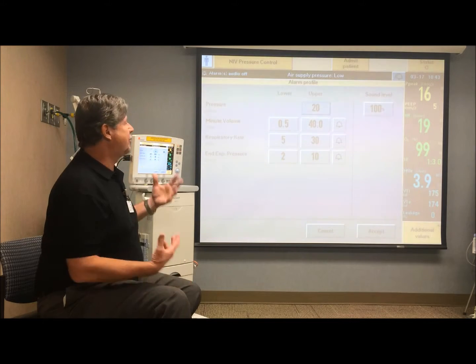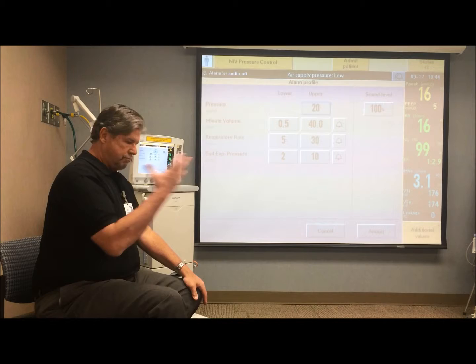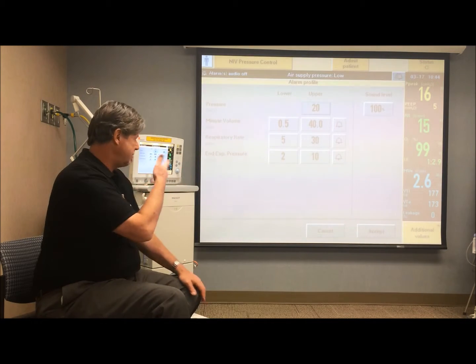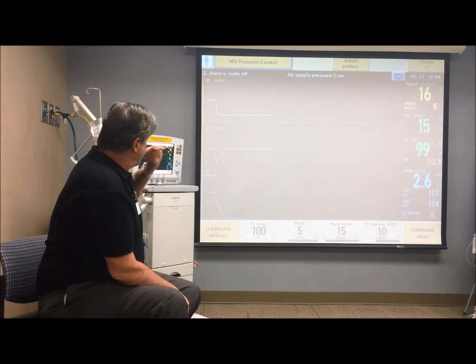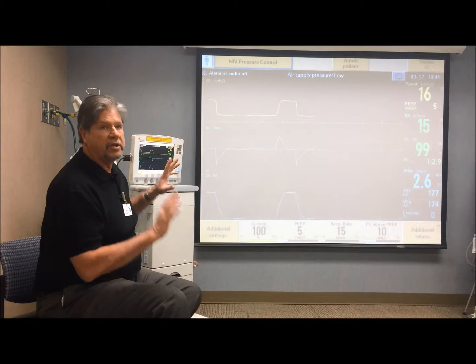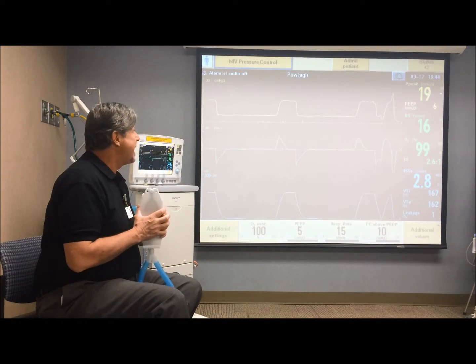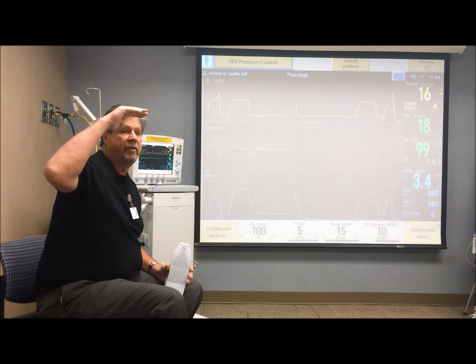So one of the problems that you get into early on with non-invasive, particularly in that apprehensive patient, is when you put the mask on, let's say you do set it at a pressure control level of 10. My PIP is only 16 now, which is not a problem, but if he's kind of struggling a little bit and pushing back, it's easy for him to hit that upper pressure limit of 20.